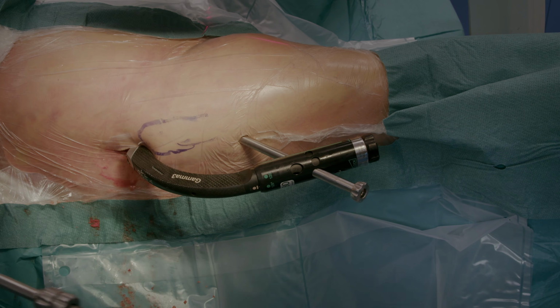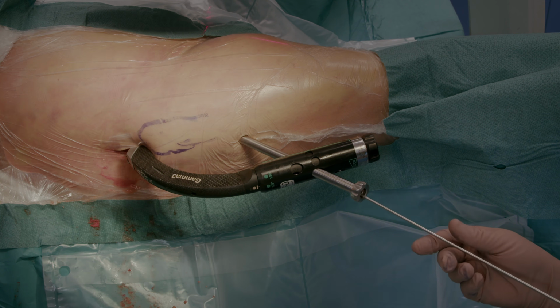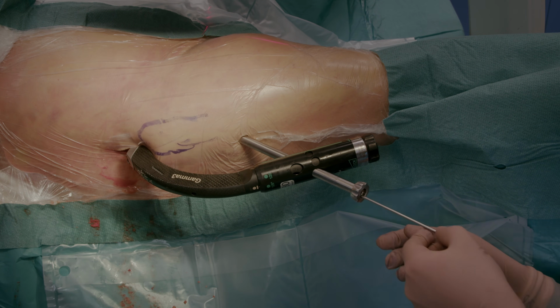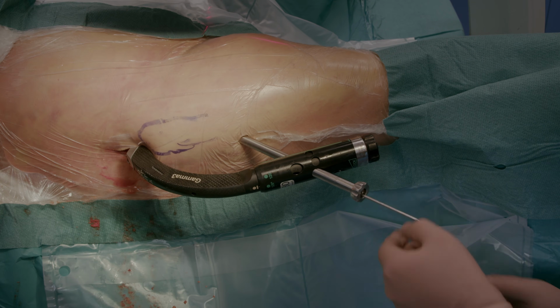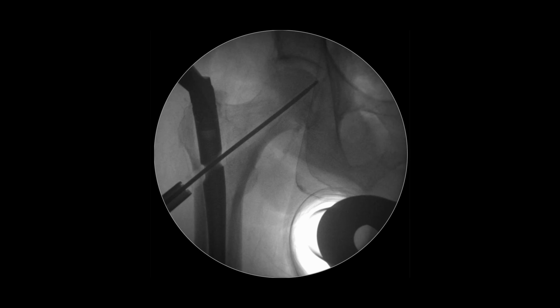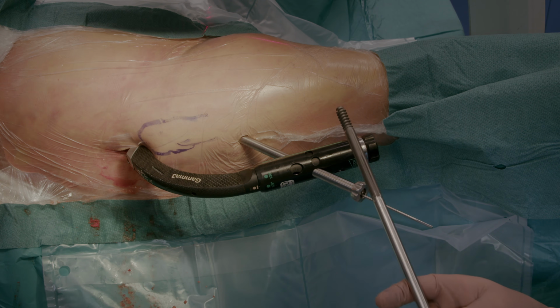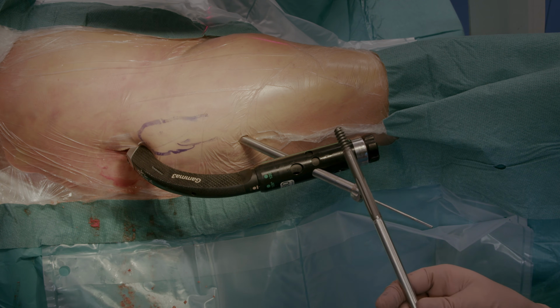The guide wire often comes out with the drill. It should be put back before insertion of the lag screw. We check by fluoroscopy that everything is in order. The chosen lag screw has been connected to the insertion tool and we start screwing it in.